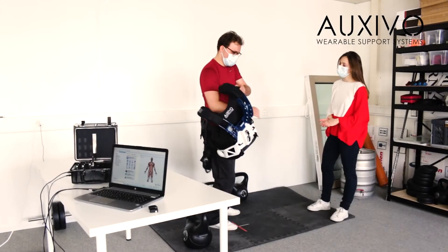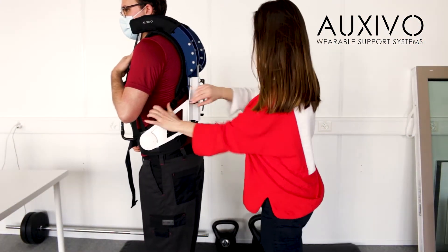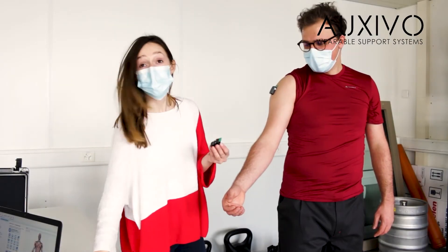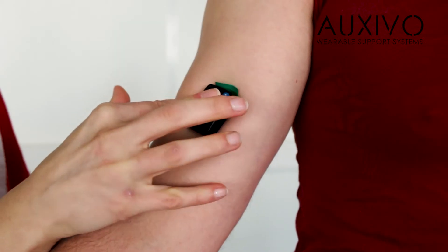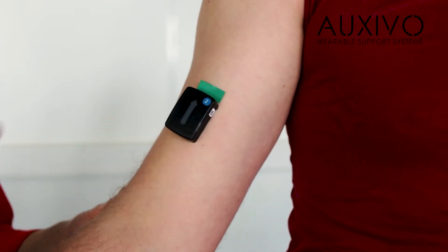Once a participant arrives I instruct them on the correct use of the carry suit and the tasks to be done. Next I will place a sensor on the skin above each muscle we want to measure. The wireless sensors stick with special skin-friendly and well-conducting double-sided tape.